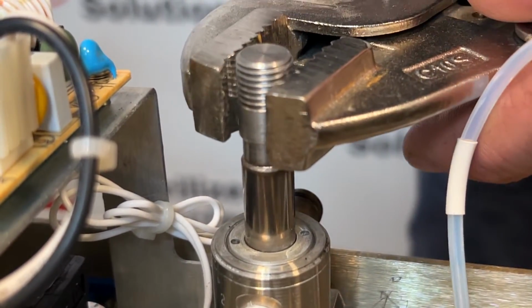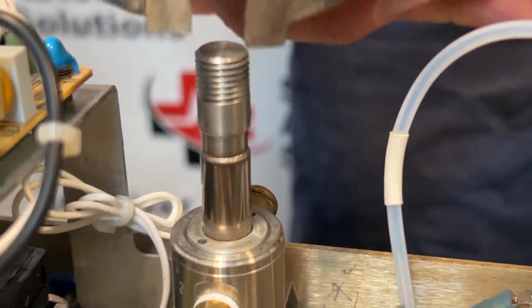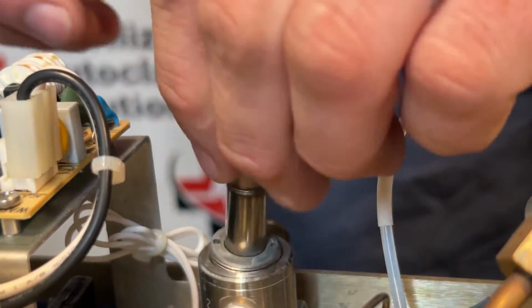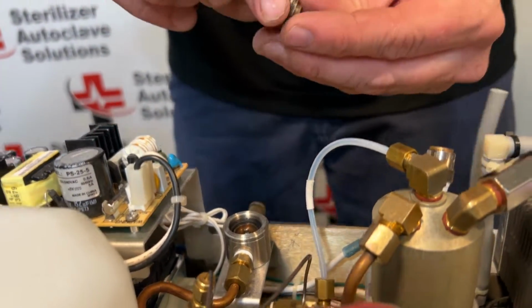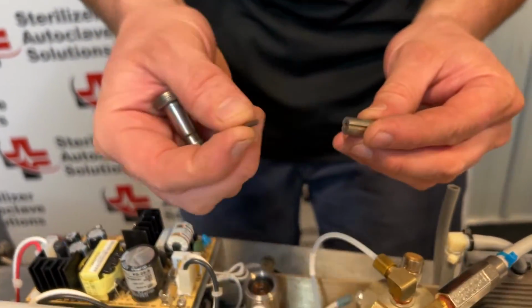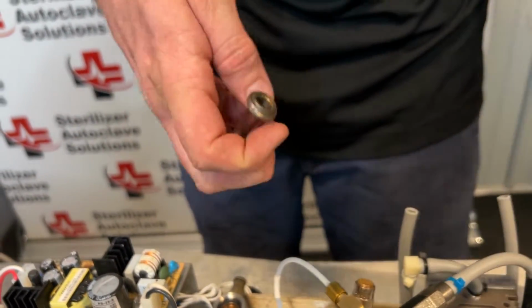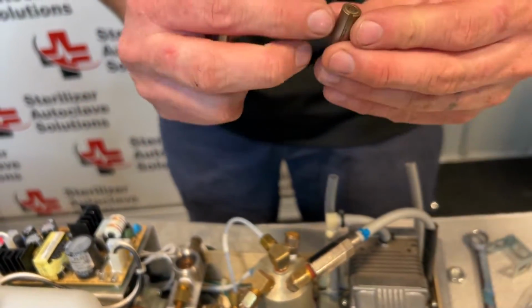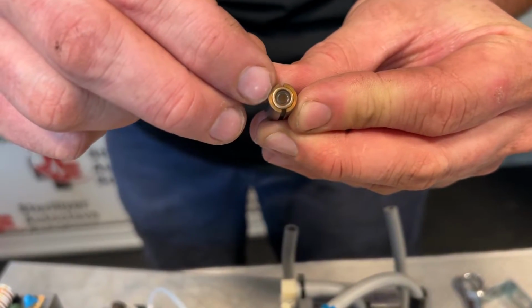And what I'm going to do is just grab on, twist, and this whole solenoid stem assembly should come out. So as we see, we are discolored. Inside of the stem, we have a spring as well as the plunger. We're actually going to replace this because if you notice, there is starting to get an indentation on the inside.